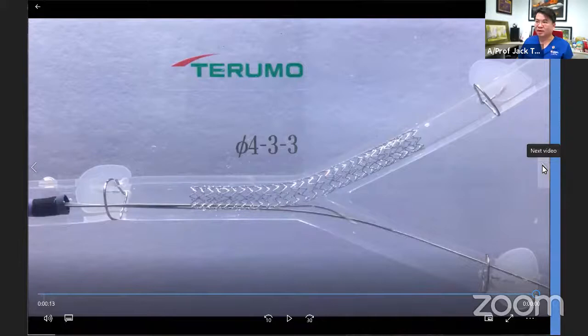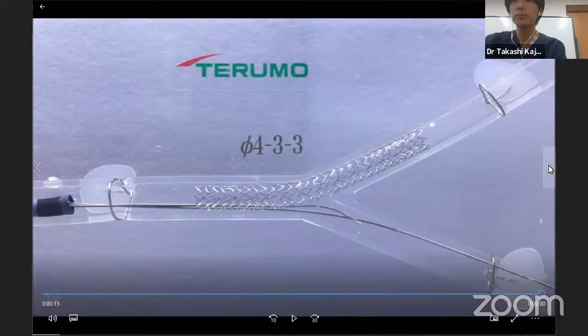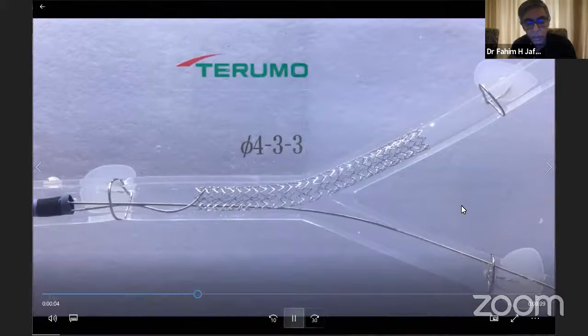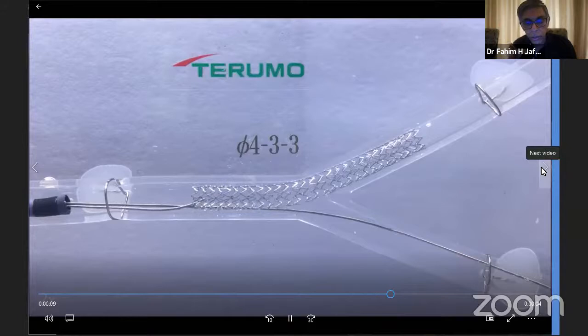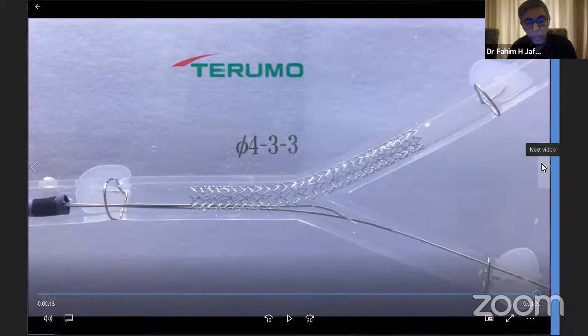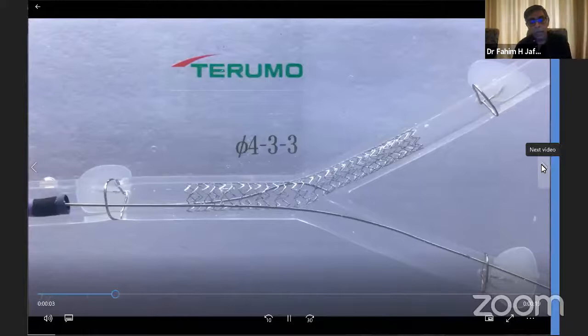Well, I agree. As was just said, it's important that the inner margin of the distal marker should be just at the carina, because beyond the inner marker, the balloon tapers very rapidly. So you need to make sure that the stent is precisely dilated at the carina. You have to make sure that the inner margin of the distal marker is right at the carina, as was demonstrated in this example. So that plays an important role.